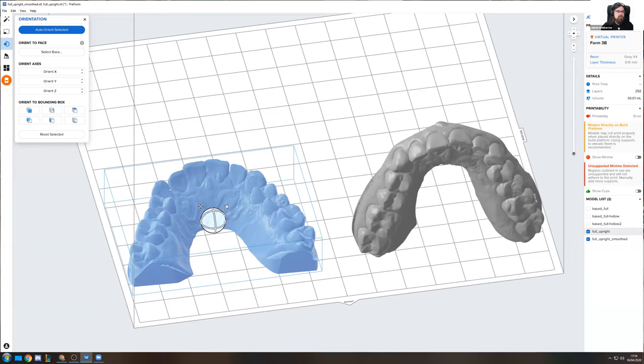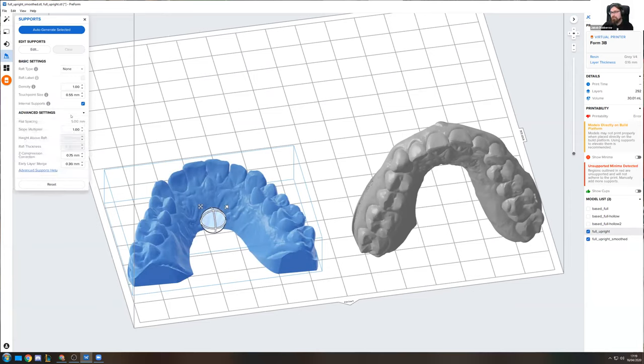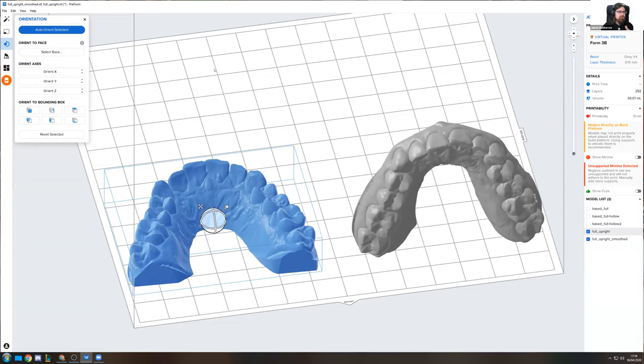Of course, there are even more additional options that you can have if you really want to. There's a lot of things that you can set there. But as you can see, you can also just live with doing a couple of clicks here and sending it off to the printer pretty fast. And then you can basically mix and match whichever you prefer.